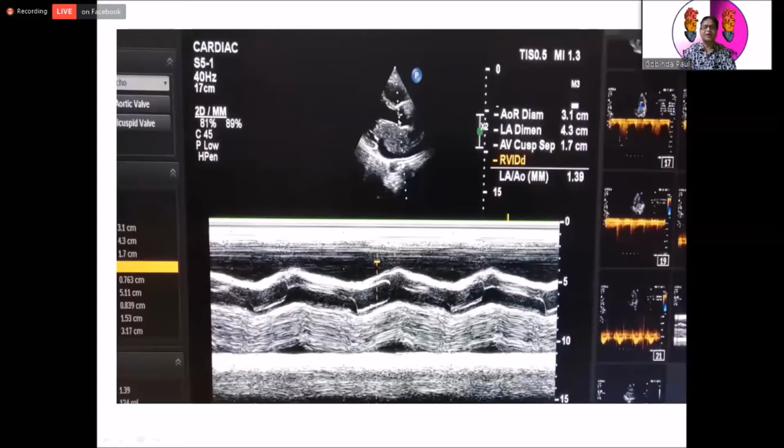Here clearly visualized when the M-mode cursor is placed over the aortic valve and the left atrium, there is a dense homogeneous shadow due to left atrial myxoma, and to some extent diastolic doming of the AML when the myxoma passes through the mitral valve and creates functional mitral stenosis.